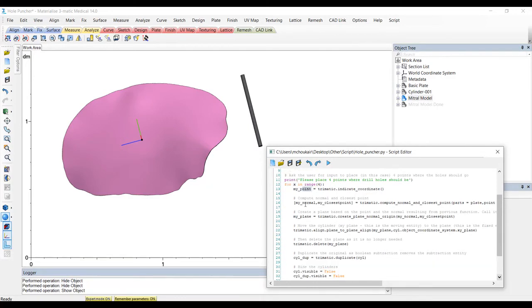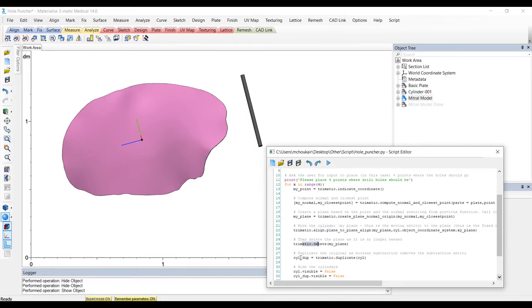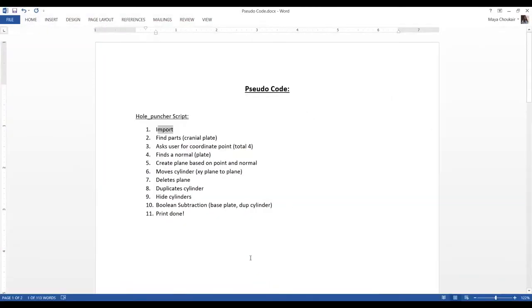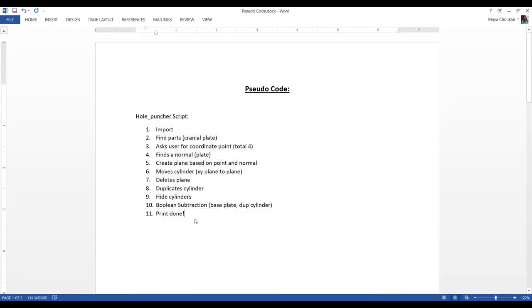Create a plane based on that normal and origin point, move the cylinder to fit that plane location, then deletes the plane, duplicates the cylinder, hides both cylinders and then does that boolean subtraction. And so here's my pseudocode of all those steps. Now, how do I change this to match my application?